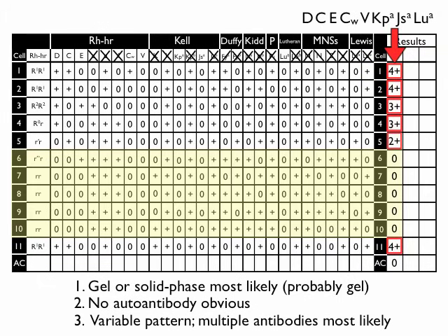Because we saw the anti-D on the first one. Well, maybe not quite, because if you take a glance at this, here are the places where D is present, and we've got reactions in every one of them. However, we can't explain the reactions in cell 5 with an anti-D. So cell 5 has additional reactions, and what you find is, again, we don't have a lot to look at because we're ignoring V, KPA, JSA, and Lutheran A. We've ruled out everything else except for big D, big C, and big E. CW is weird.